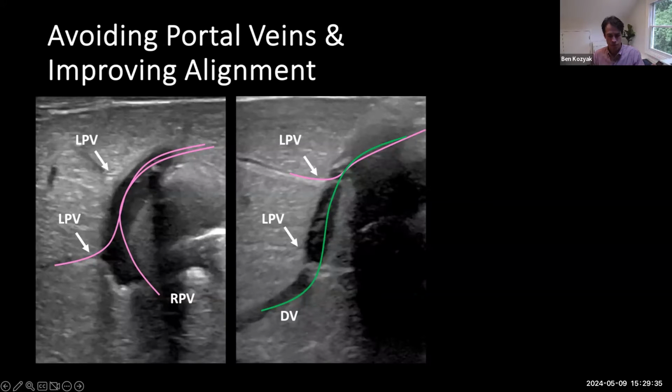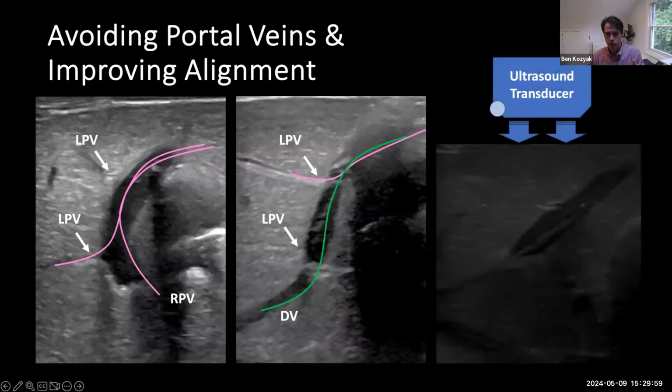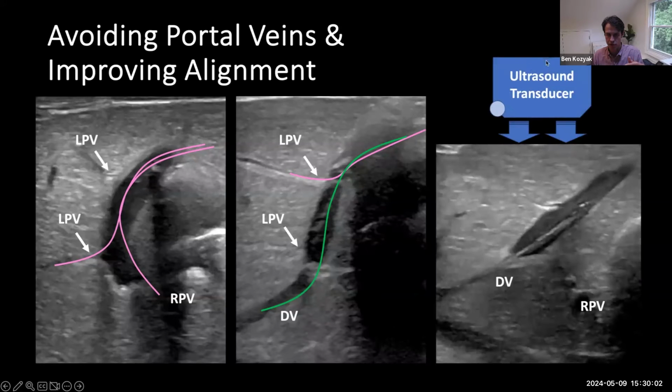So the main manipulations that are done while placing an umbilical venous catheter are liver pressure, right? Some positioning changes and line over line stuff, but push on the liver this way, push on the liver that way, and see if you can get it to go. And with ultrasound, you can see why that is the time-tested strategy for trying to get difficult lines into position. When you push with your ultrasound transducer a little, or when you push on the belly from anterior to posterior, a little bit of posteriorly directed compression, the anatomy changes.